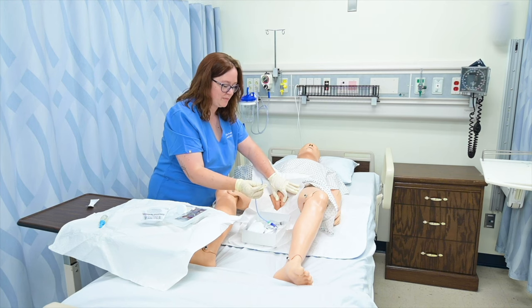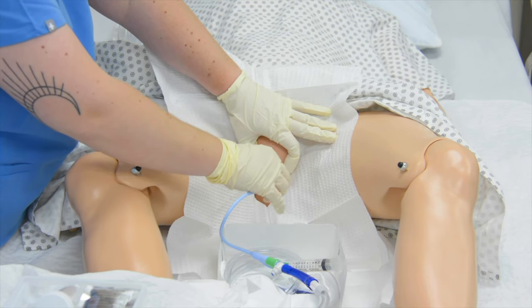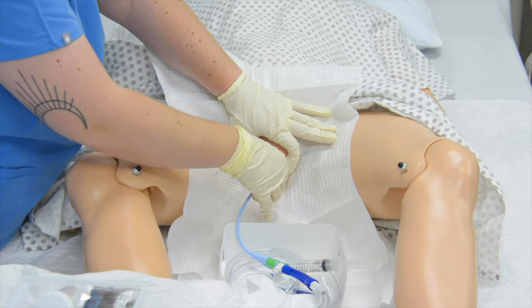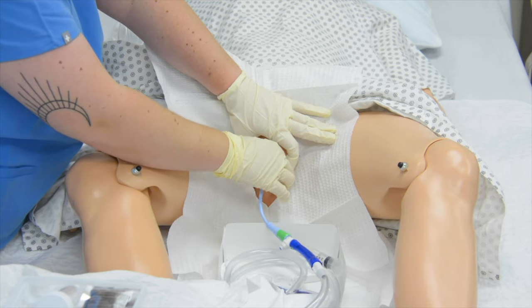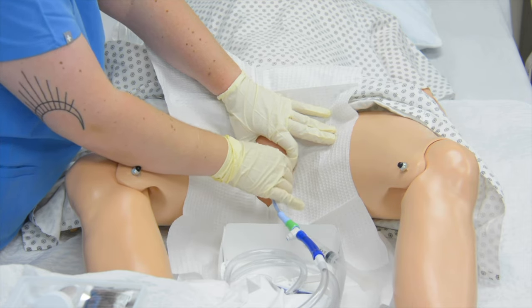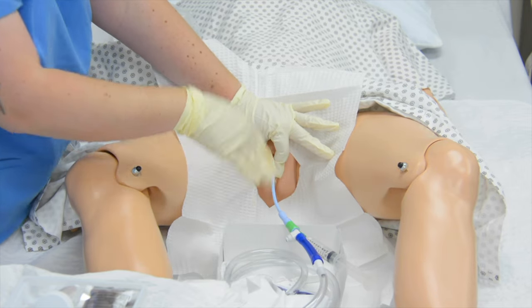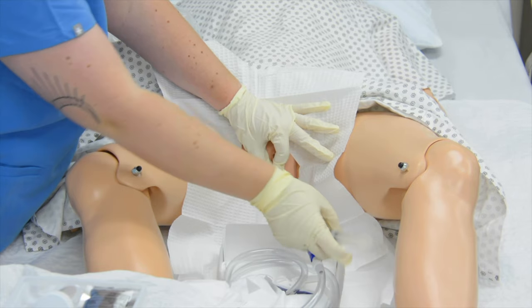I'm going to pick up the end of my catheter and insert it into her urethra. I'm going to ask my patient to bear down. Once I see urine flow in the tubing, I'll insert another two to three inches for female patients. Then I'm going to pinch that with my left hand so it doesn't accidentally shoot back out, because sometimes the pressure can make the catheter tubing exit.